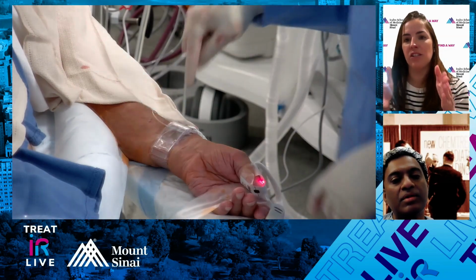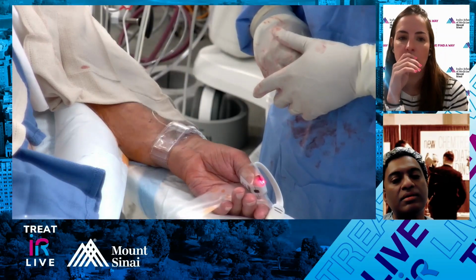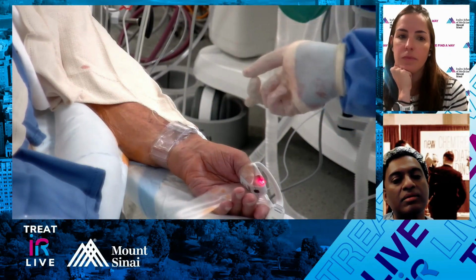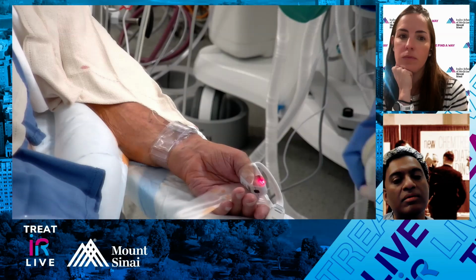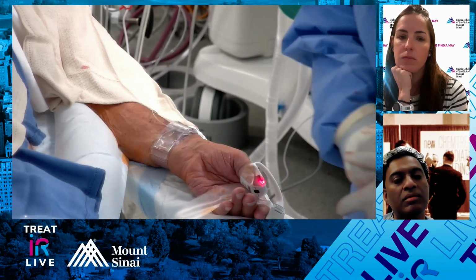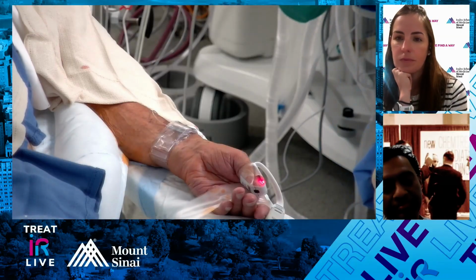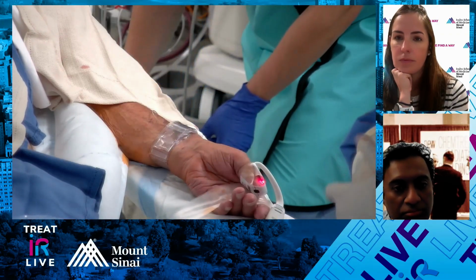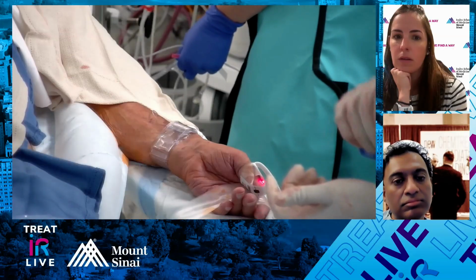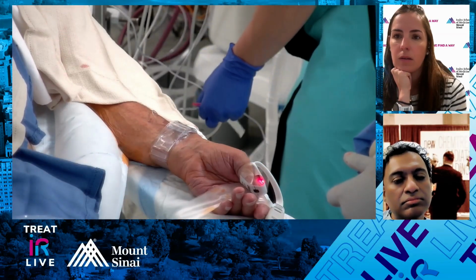It's not really in the middle. It's on the side. So it has to be that way. Technically speaking, it's actually upside down because it's designed for right radial. So it makes it a little bit hard because there's a window to see into the spot where it's bleeding, and it's opposite of where it should be if you were doing a left radial. It's fine, though. We've been using this for a long time. There are other ones that have a ratchet mechanism that you screw down, so there are different ways of doing it.